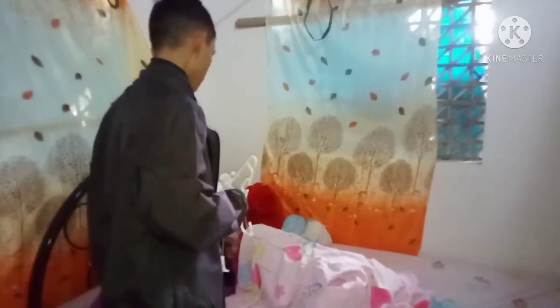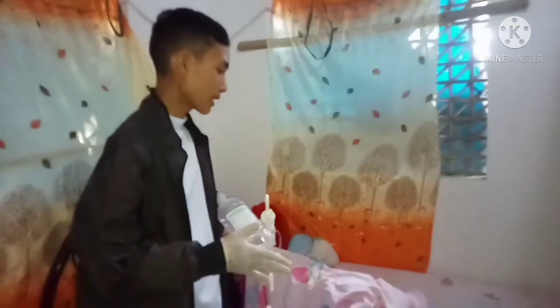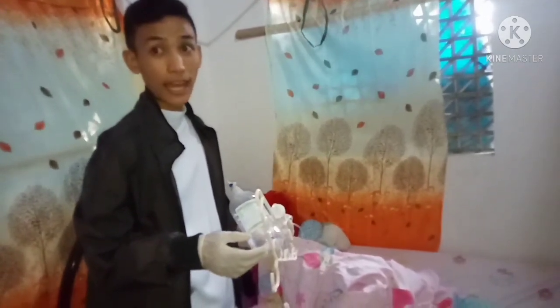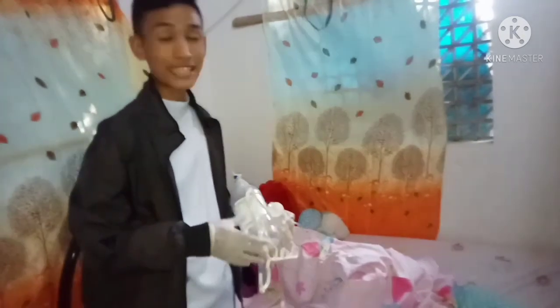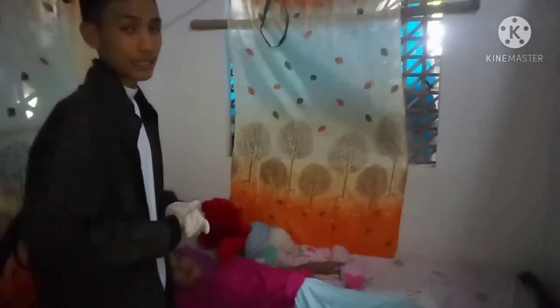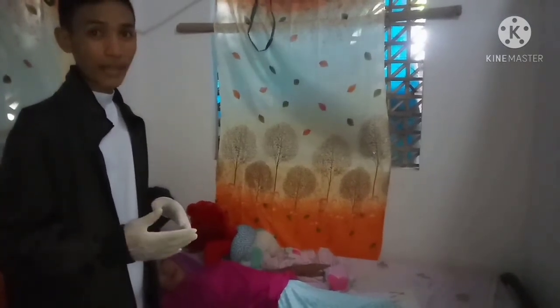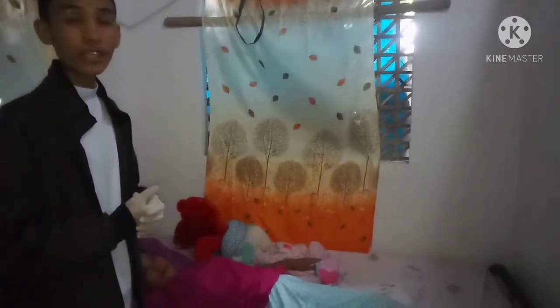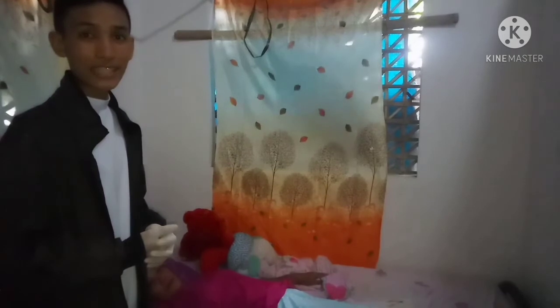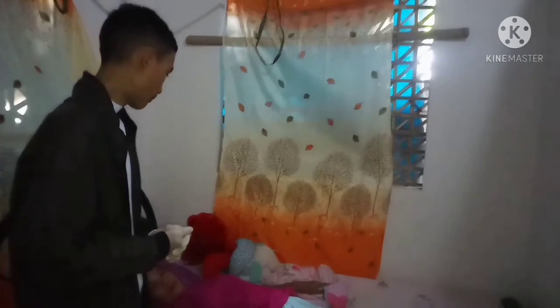Okay ma'am? So remember that after we remove it, we need to cover the patient and provide dignity and privacy, and we need to gently remove the enema. After that, we will assess the client going to the CR, especially if they are able to ambulate. After the patient is done with the 5 to 10 minutes, we will assess the client going to the CR, and we will provide aftercare and assess the client in a comfortable position, and don't forget to document the care that we have done to the client. Ma'am, let's go to the CR.